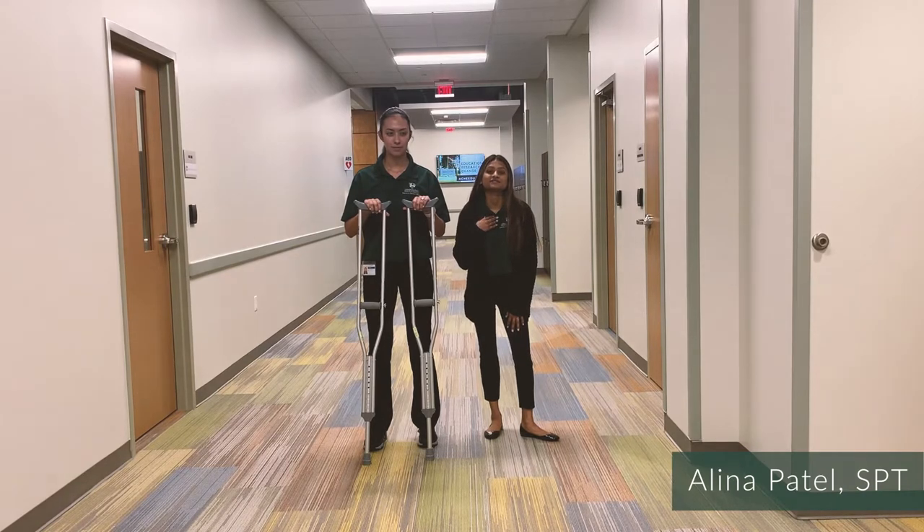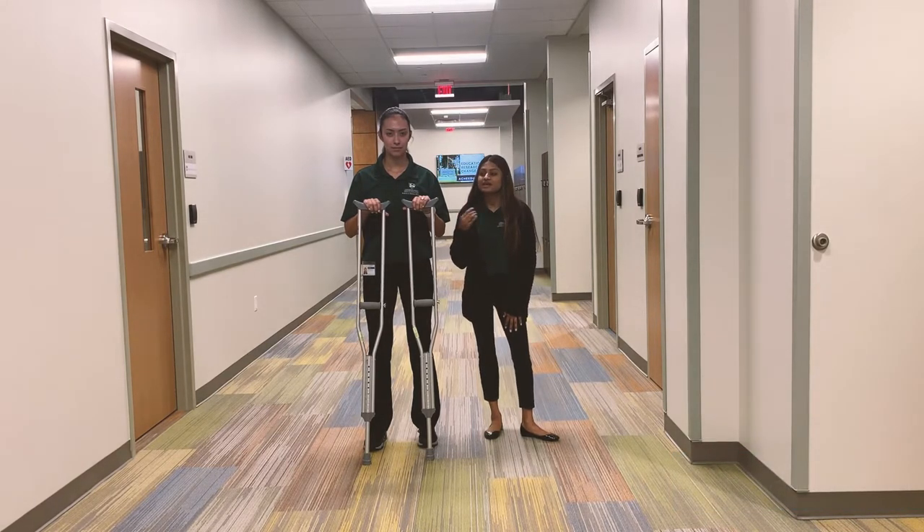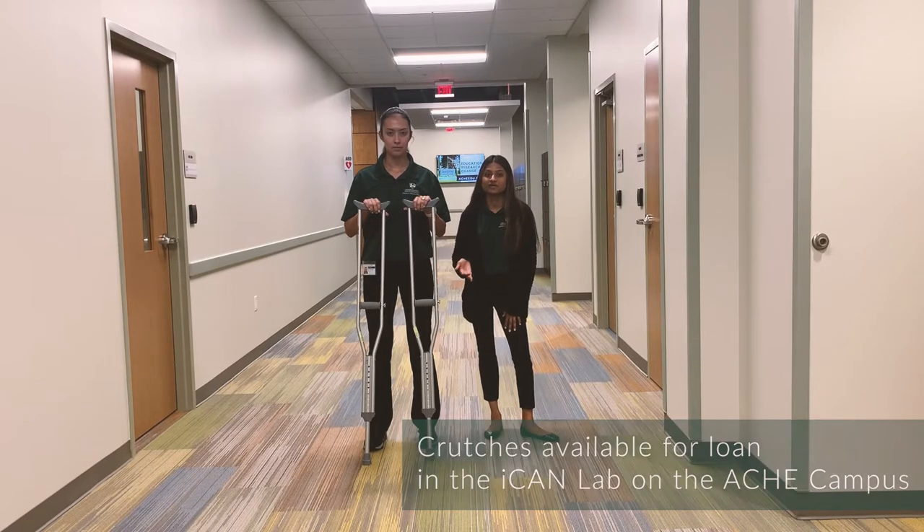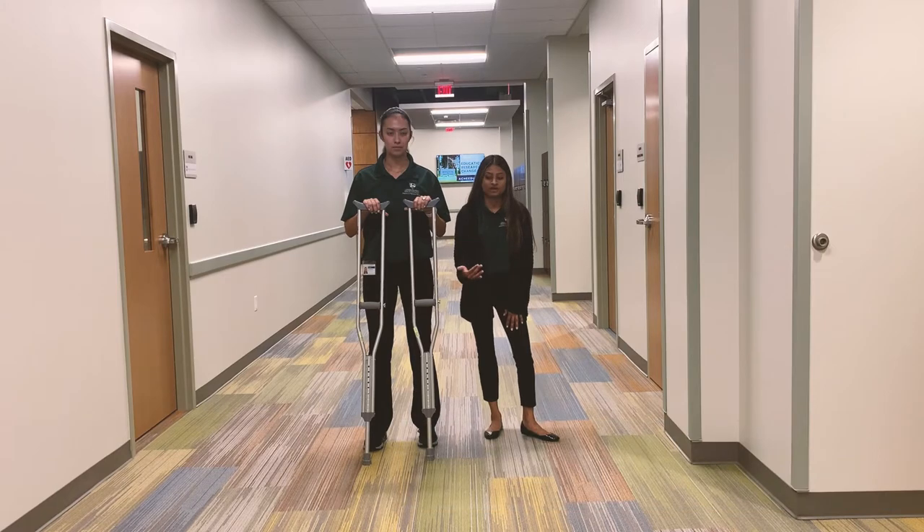Hi, I'm Alina. I'm a physical therapy student here at ACHE. Here I have some crutches that are used for individuals who are unable to bear weight on either leg while he or she is walking.